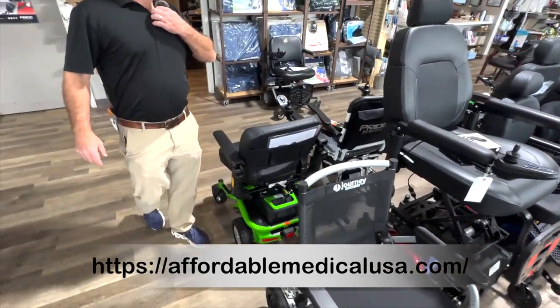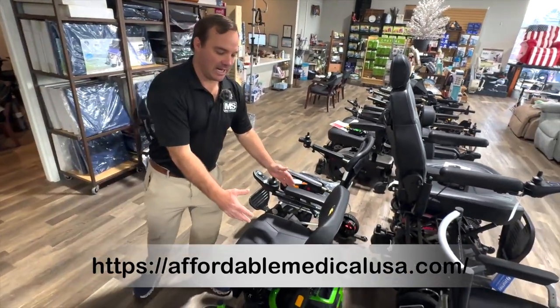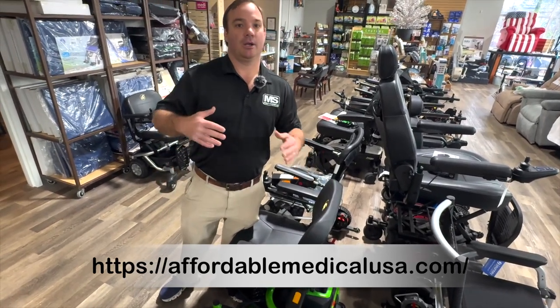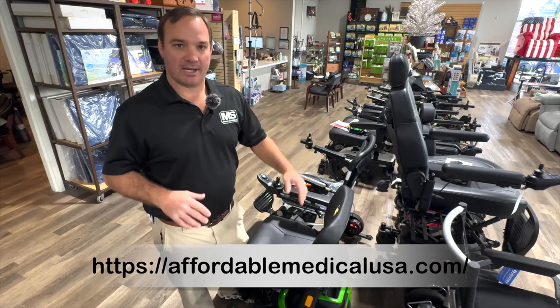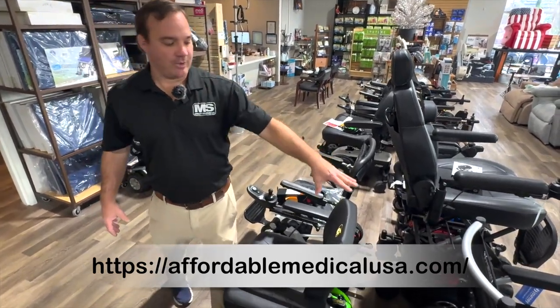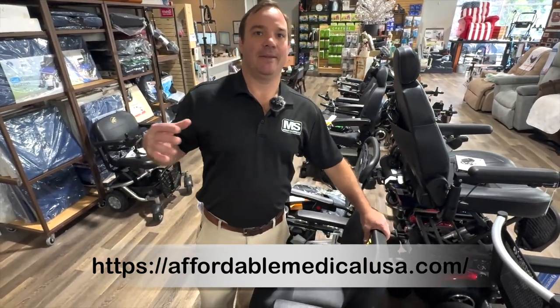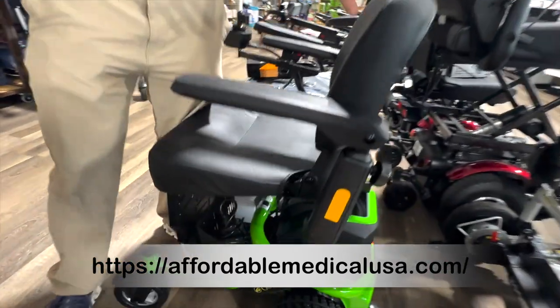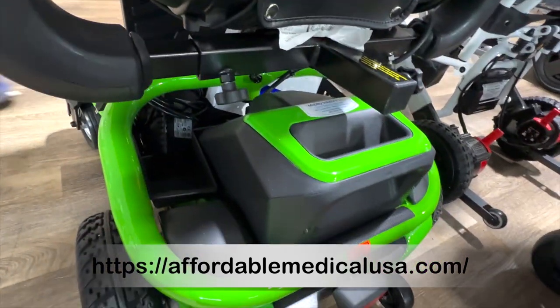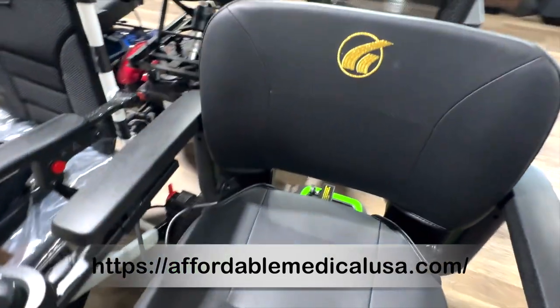Envy power chair. Envy and Go Chair — I like to keep them as competitors. You can get this in different seat heights and different seat widths, and you can upgrade to a nicer seat — they have a little bit higher back seat option. Why would you buy this over the Go Chair? I would say if you're going to be using it more outside. This is a little bit better outside, a little bit better distance, because they're putting 12-volt 22 amp-hour batteries in here. It disassembles — very nice chair.